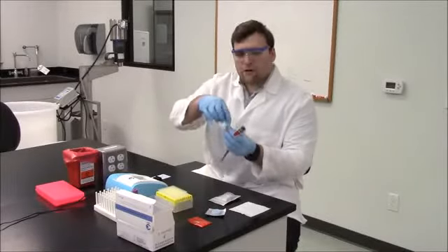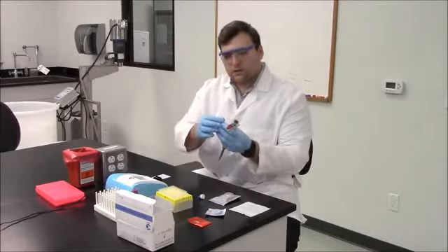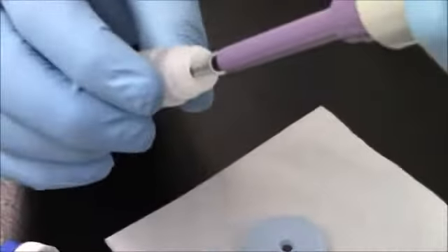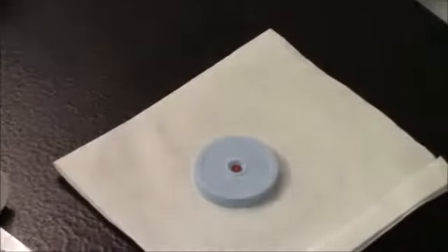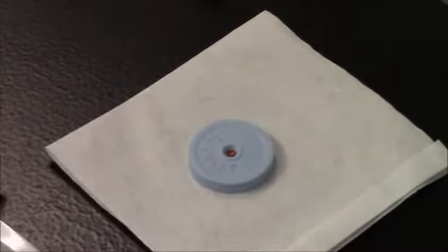Once the disc is dried, after adding reagent 1, treat reagent 2 in a similar manner. Back pipette 25 microliters of reagent 2 onto the disc. While pipetting, make sure that you do not touch the disc and that you do not create any air bubbles. Once the disc is dried, load it into the chamber and click Test.